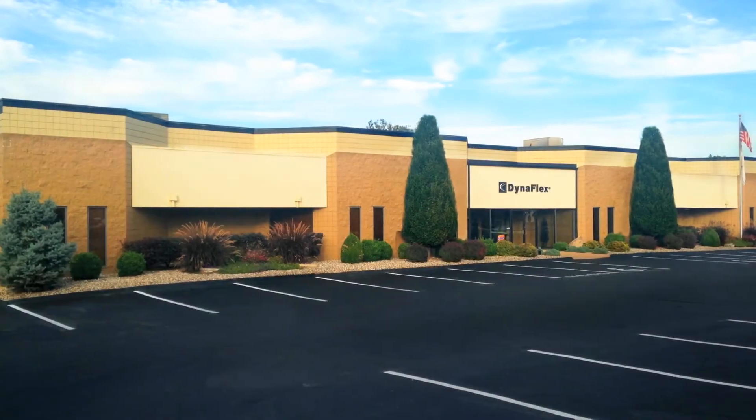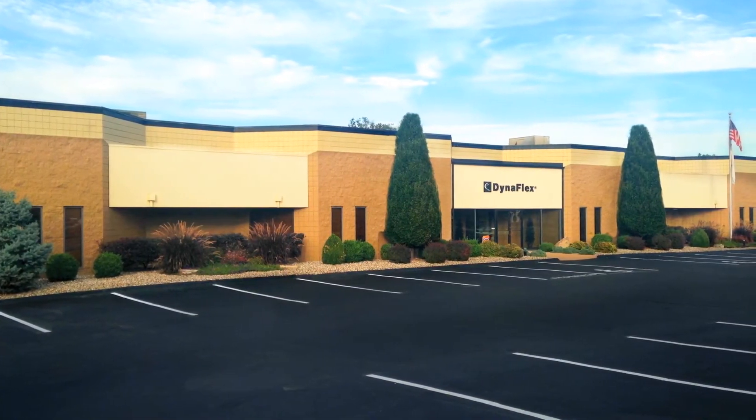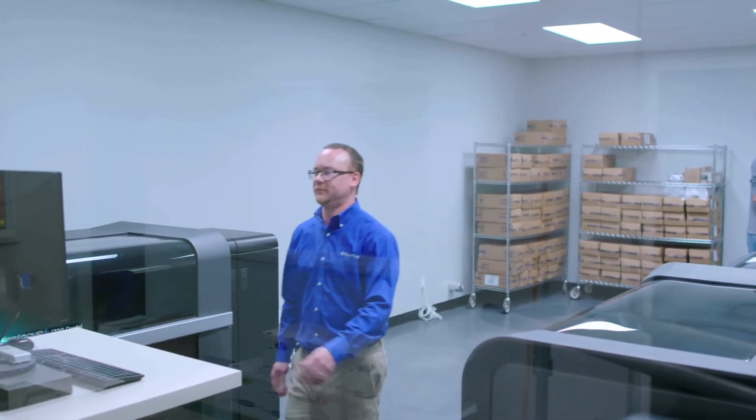DynaFlex started in 1965 as a very small orthodontic laboratory. In the early days we selected the Objet 260 because we didn't know where the market was going initially, and now looking at the clear aligner market and knowing the potential growth.